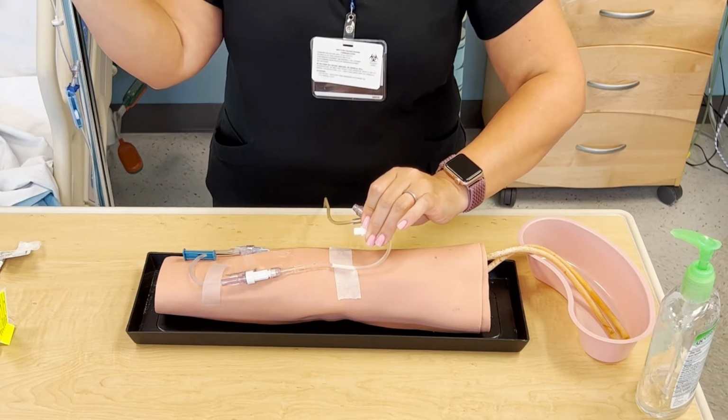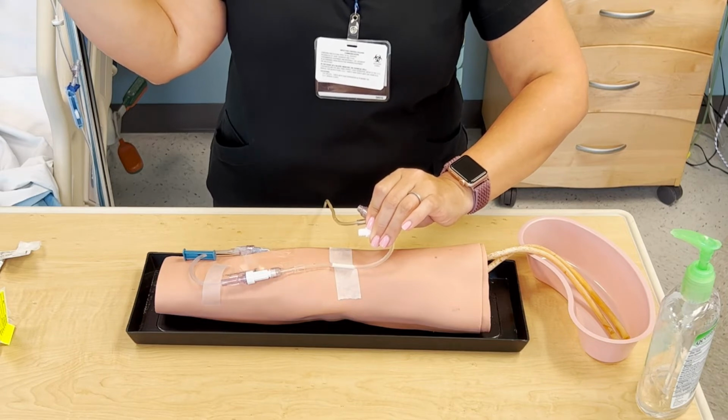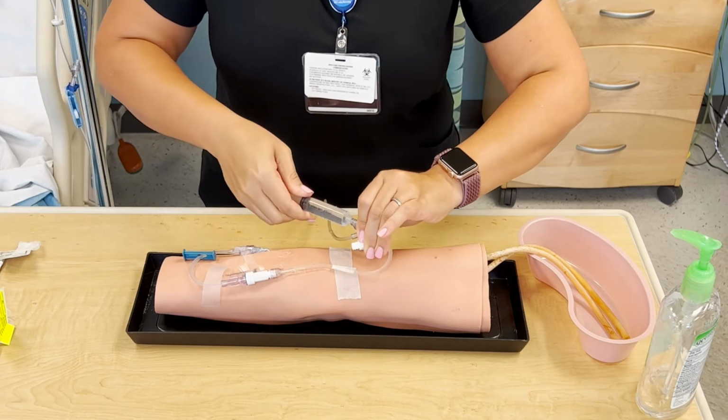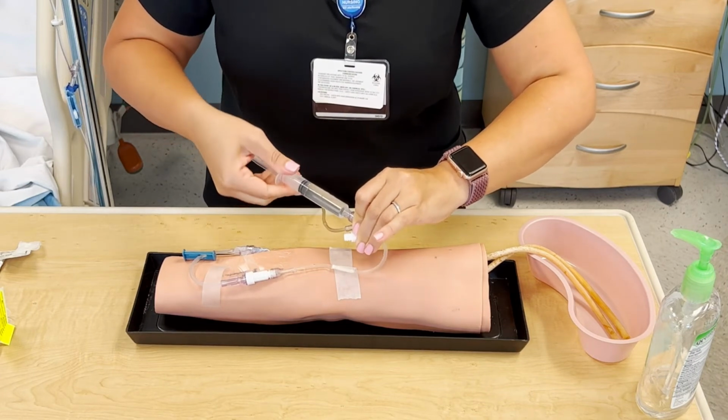Make sure you have gotten enough out so that you're on a line so you know where you're starting. And you should be flushing the first milliliter at the same rate that your medication went in.